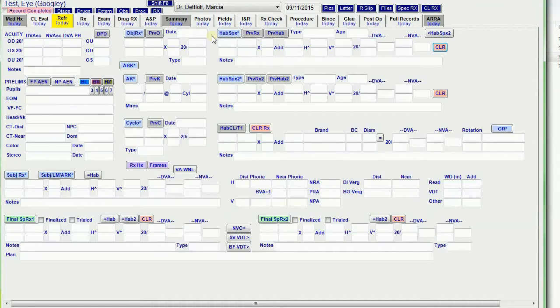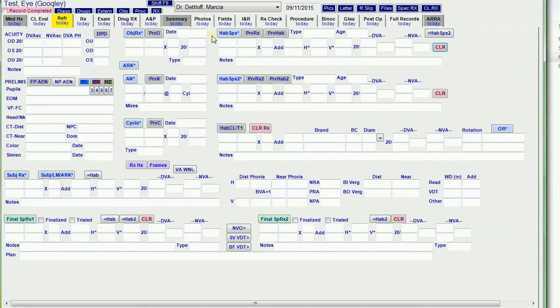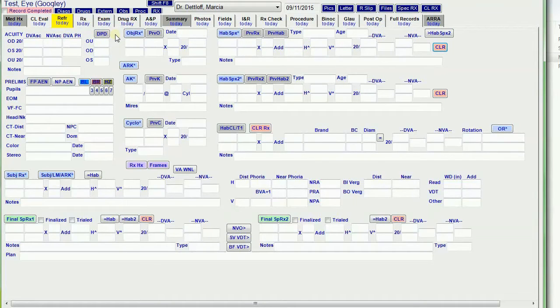Over here I've got the distance PD. That pulls forward the previous PD, the binocular and monocular.